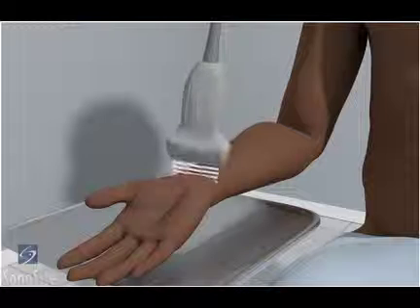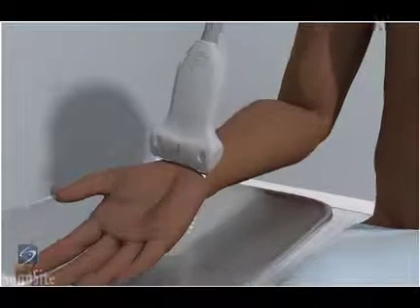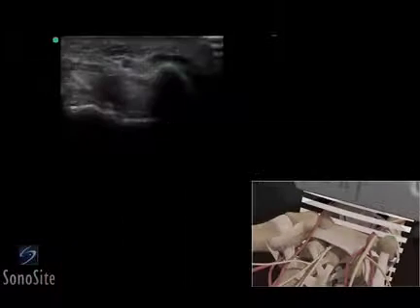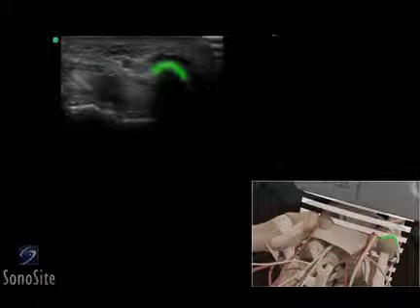The transducer is placed over the wrist crease in a transverse fashion with the orientation marker directed toward the patient's right. The pisiform bone is seen as a bright, hyperechoic prominent structure. The ulnar artery is a round, pulsatile structure above the flexor retinaculum, which appears as a hyperechoic line.